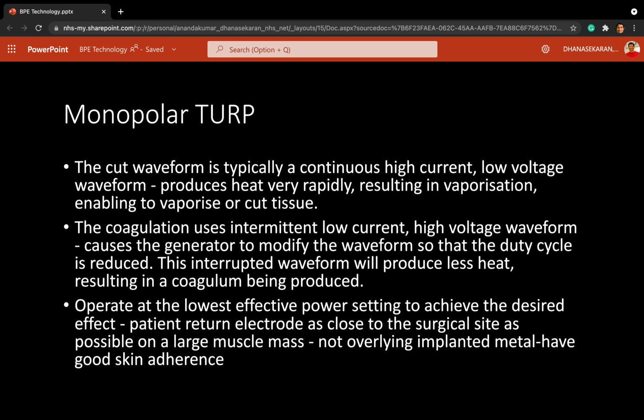Specifically with monopolar, so for each procedure, I'll explain to him how the procedure is performed and the overall benefit in improving his LUTS and preventing progression. I will outline the difference between each of them in terms of hospital stay, transfusion, and side effects.